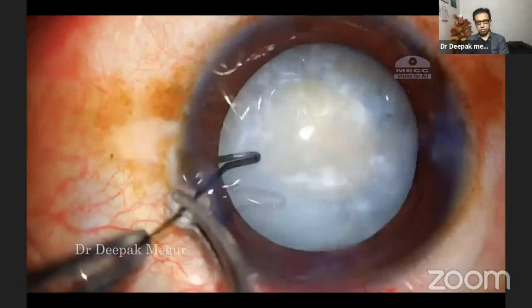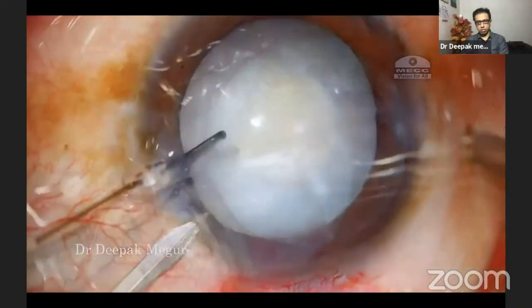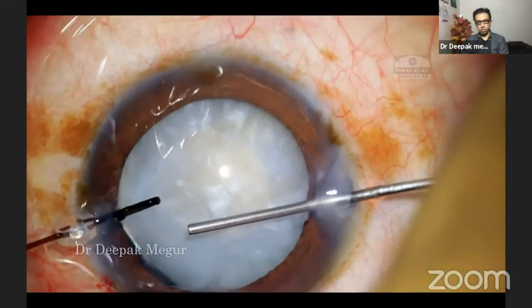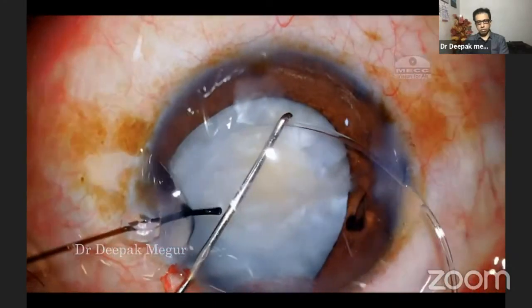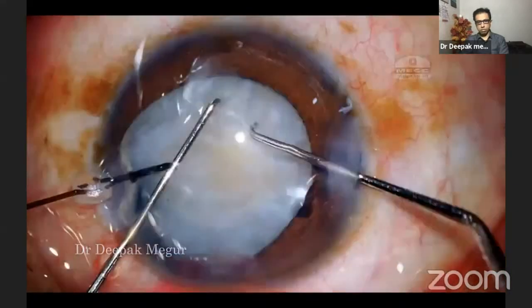To engage the area with zonular dehiscence, I'm making another side port to introduce my chopper. Again, I'm using dispersive OVD to block that area. Now I'm planting the CTR. I always support the ring with my left hand using a Sinski hook, and the last part of the ring is dialed in using another Sinski hook.